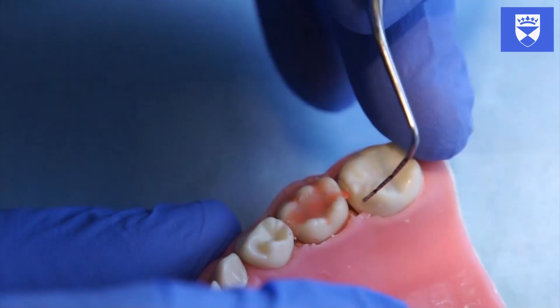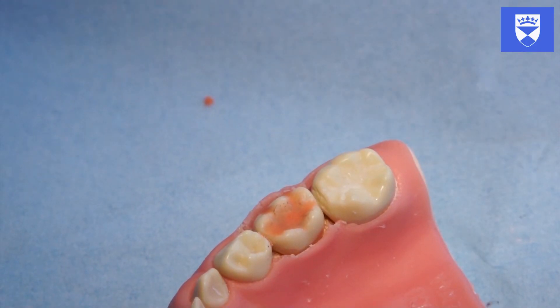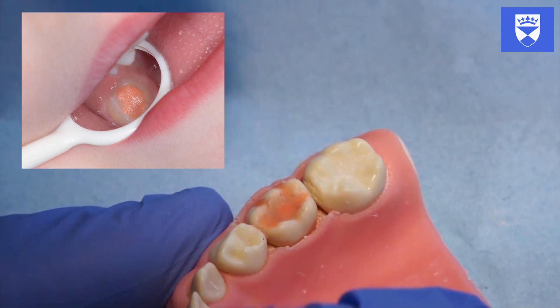When happy with the restoration, place petroleum jelly on the occlusal surface. Remember, in the mouth this will have to be done immediately after you lift the finger that was pressing on the glass ionomer.